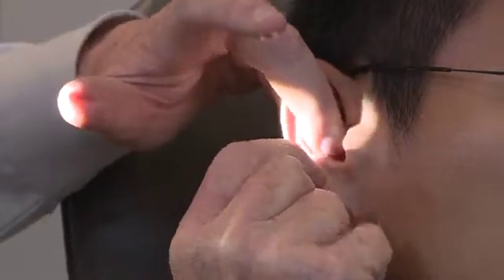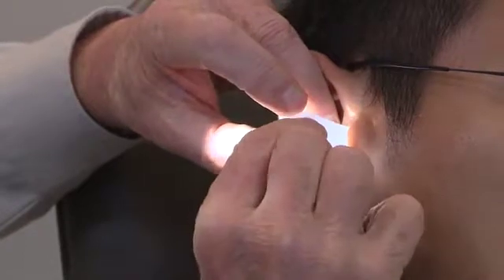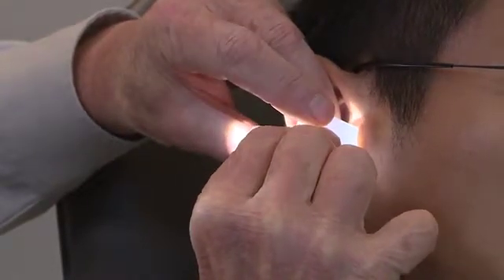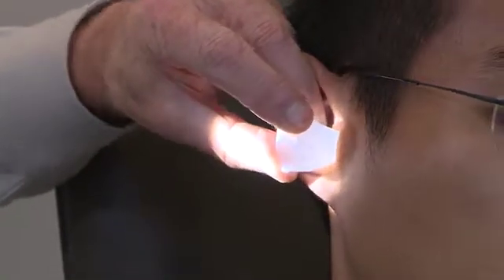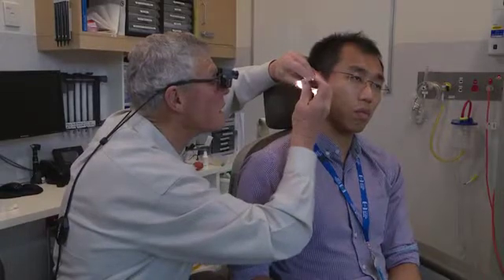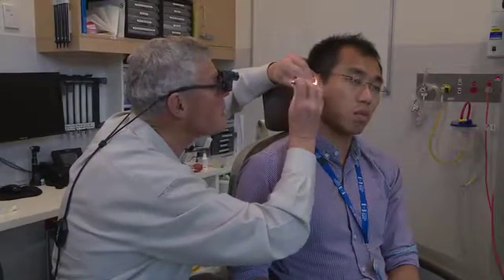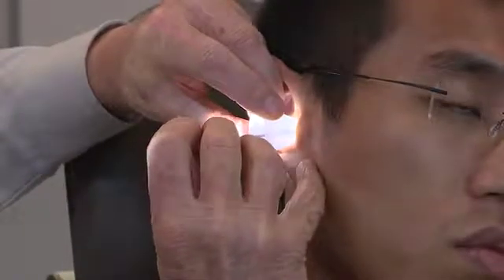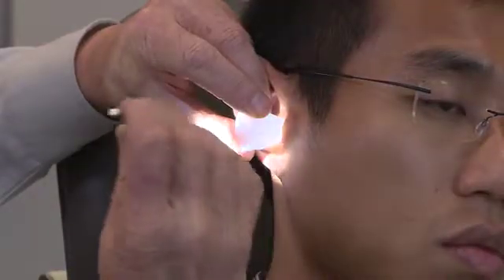You have to do this quite often if you've got difficult deep wax — you'll be instrumenting with this combination. So: pulled the tragus forward, looked through the speculum, used thumb and first finger with two hands to get it into exactly the right position, and then switched over to just one hand. Then with the instrument you just go up — the fifth finger you can rest anywhere: on the side of the head, on the edge of the speculum, on your finger. But if you don't do that, you're taking a risk. It's amazing how precisely you can see what you're doing, loosen wax, and then remove it. In the outer canal it's not likely to hurt, but a lot of difficult wax will be in the deep canal. That's when this concept of loosening it and lifting it before you try and roll it out really pays off.